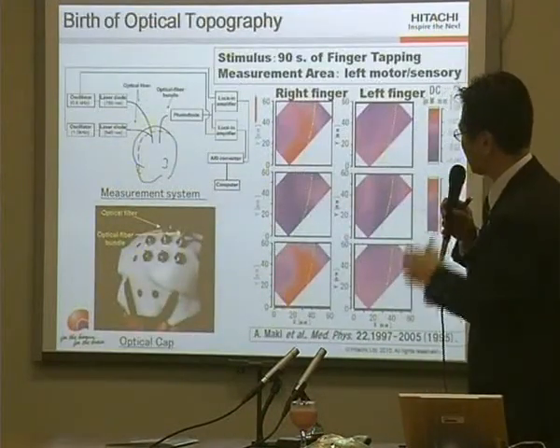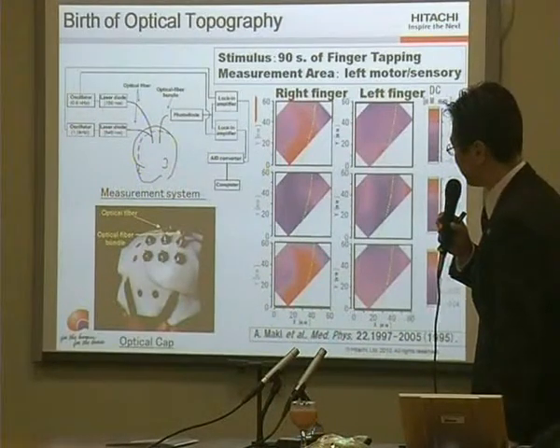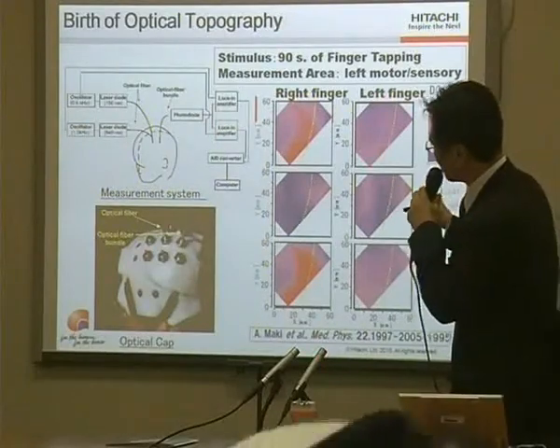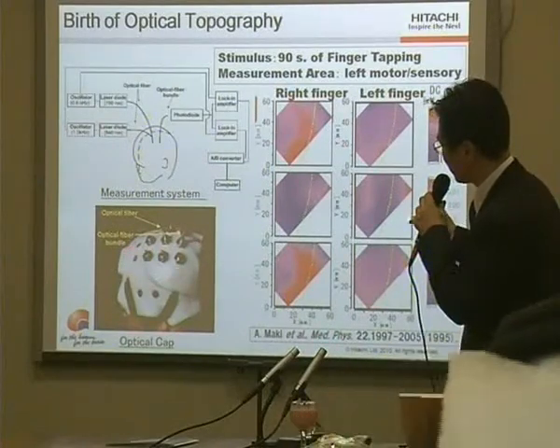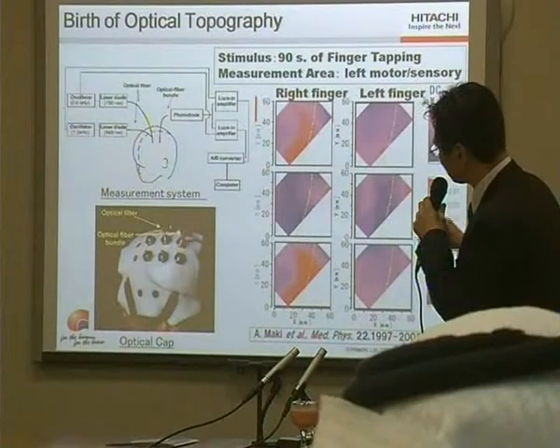And this is the first study using the optical probe system. At first, I made this thermoplastic helmet, and we put the optical fiber like that.